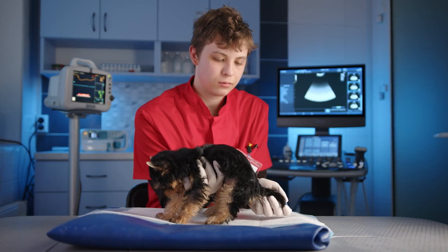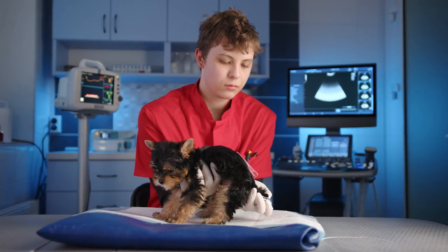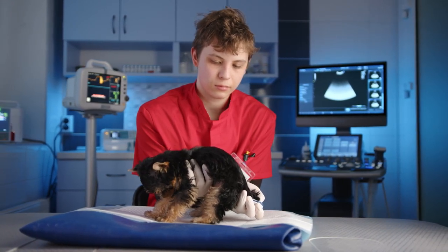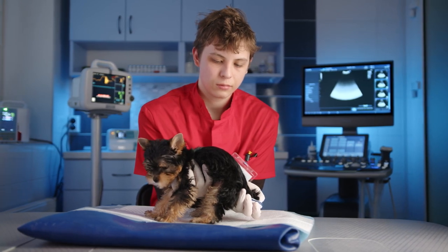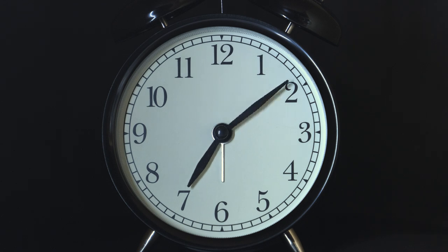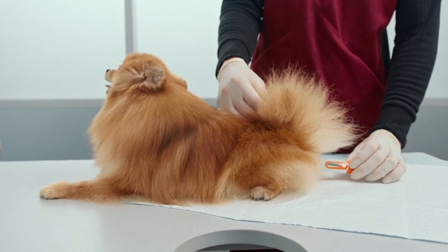Insert the thermometer. Carefully and slowly insert the thermometer into your dog's rectum about 1 to 2 inches. Be gentle and stop if you encounter any resistance. Wait for the reading. Most veterinary thermometers will provide a reading within 1 to 2 minutes. Make sure you are within a comfortable distance from your dog as they may try to sit or move around.